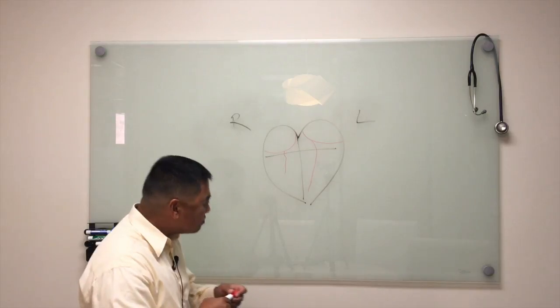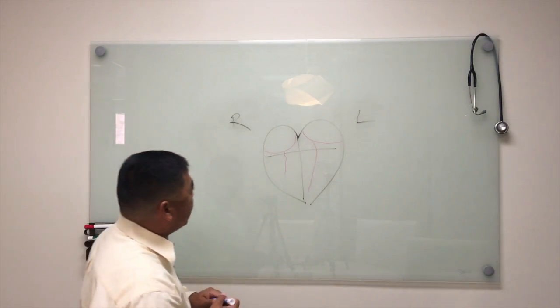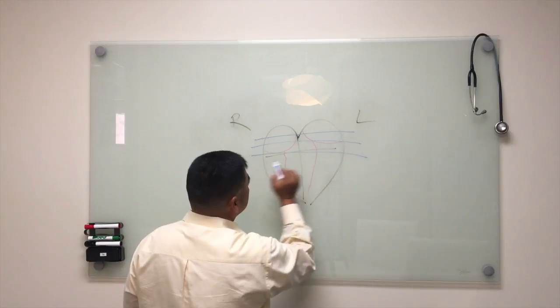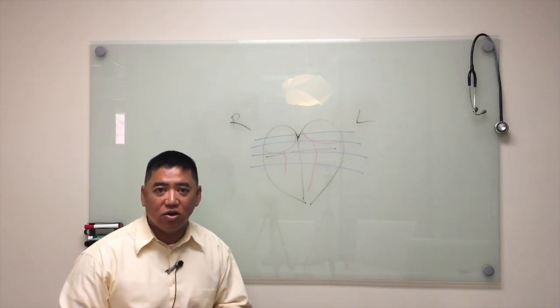What we're looking at is the CT scan is going to look at different levels of your heart and identify where these blockages are.